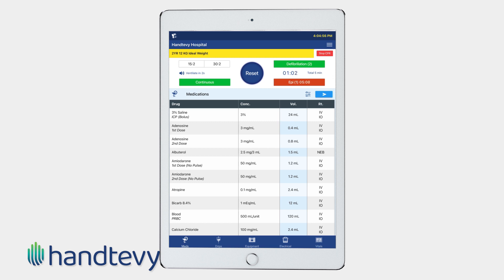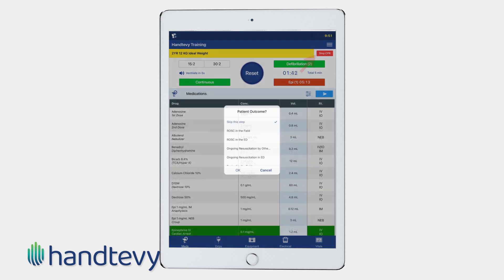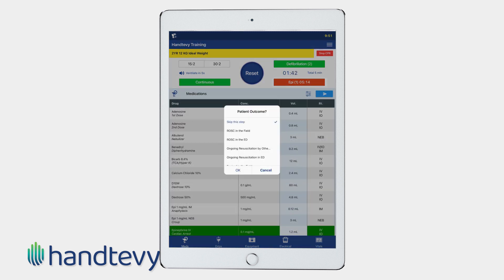Upon completion, document the outcome of the arrest by pressing stop CPR. All of these time intervals have been documented and can be reviewed during CQI.